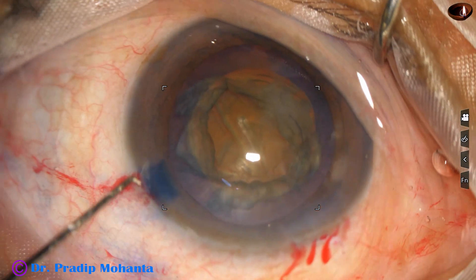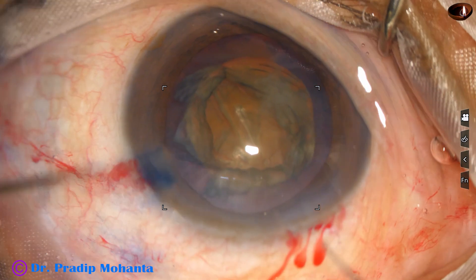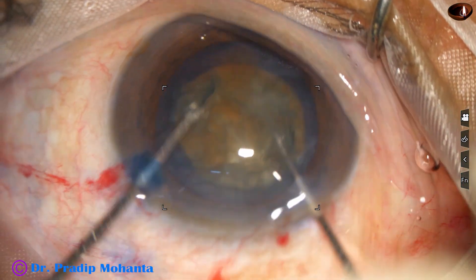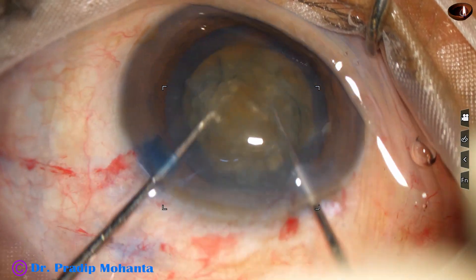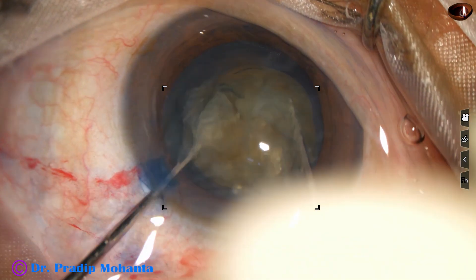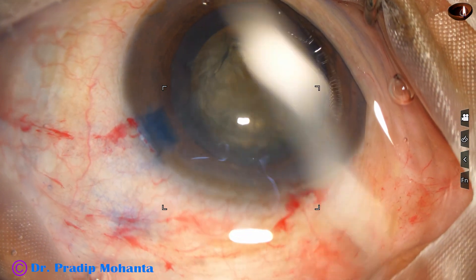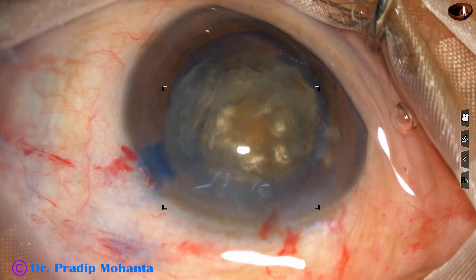Now rotation of the nucleus is being done bimanually. Bimanual rotation doesn't cause much zonular stress. Rotation is complete.